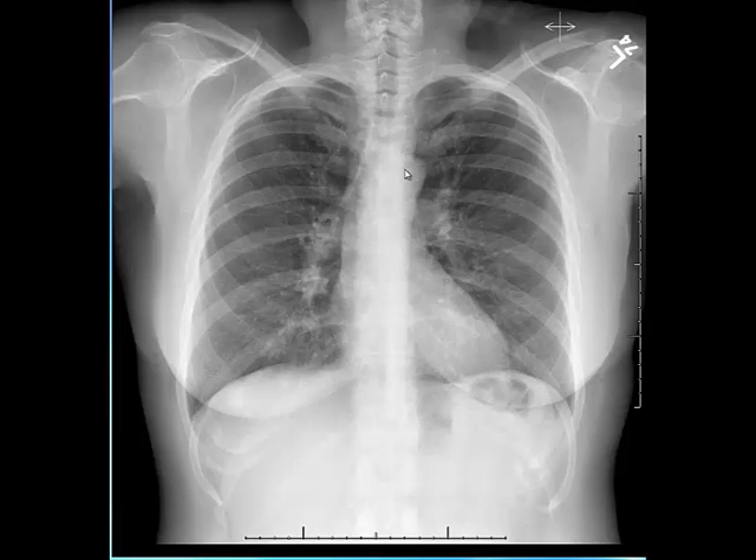The third thing I evaluate in the technique is the degree of penetration. An adequately penetrated film should demonstrate at least the first three to four spinous processes of the thoracic vertebra. For example, this is the first thoracic vertebra and we see very well the first, second, third and fourth spinous processes, meaning there is adequate penetration. If we see fewer spinous processes it's under-penetrated; if we see more it's over-penetrated.